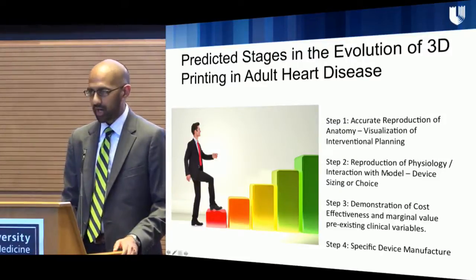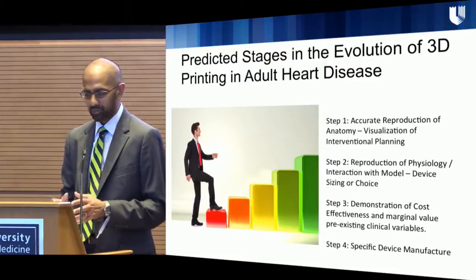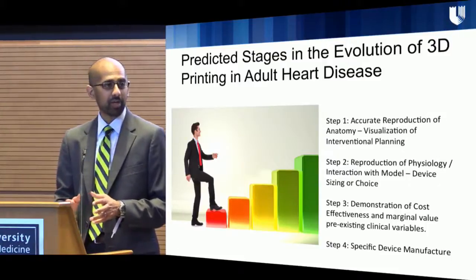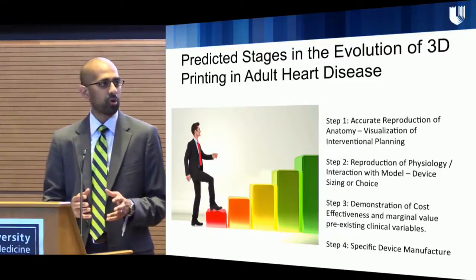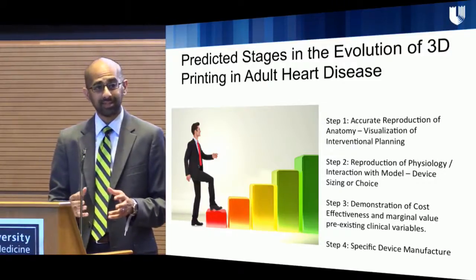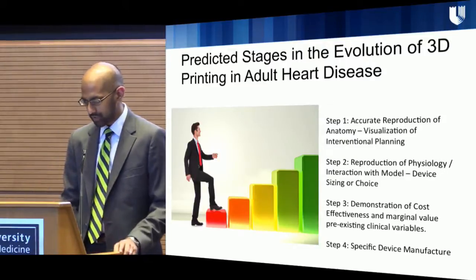Step two, how about we actually reproduce physiology and anatomy with a 3D print? That might be helpful. You can imagine having a 3D print, being able to deploy your TAVR into that print and then assess it for PVL, all before doing this in the patient.